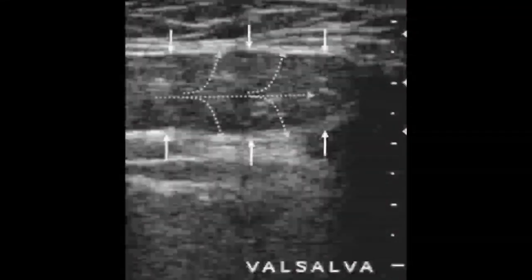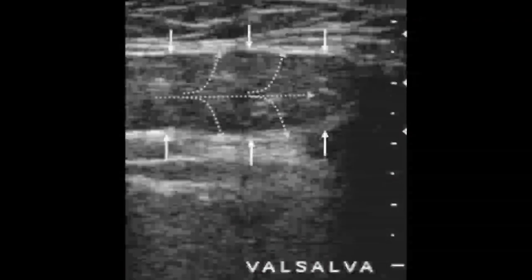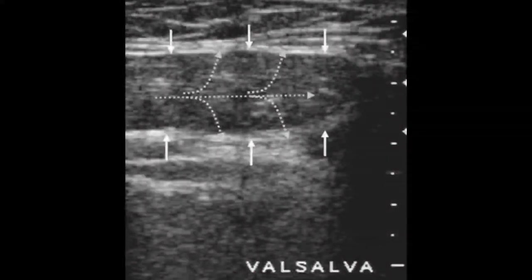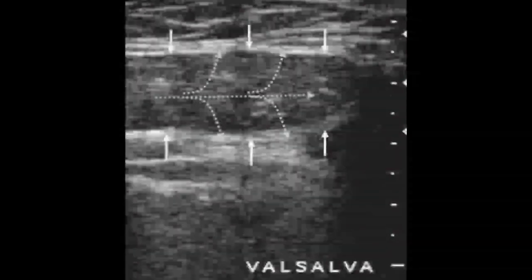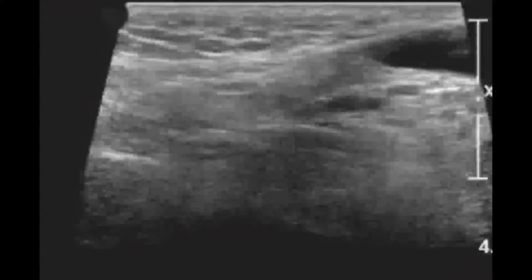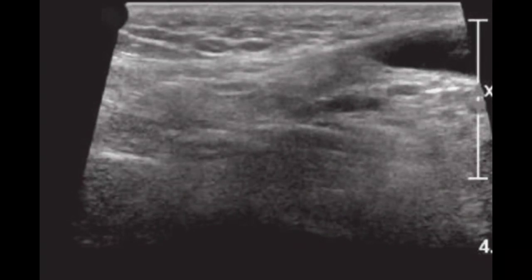This image shows the same case with the Valsalva maneuver — a long-axis view of fat-containing indirect inguinal hernia during Valsalva. Look at the size — it has increased because of the Valsalva. When you apply the Valsalva maneuver, forcefully this fat enters into the hernial canal. On quiet respiration, the hernial sac is not that much dilated, while on the Valsalva maneuver you can easily appreciate that the canal has been dilated and the hernial content has been pushed forcefully within the hernial sac.